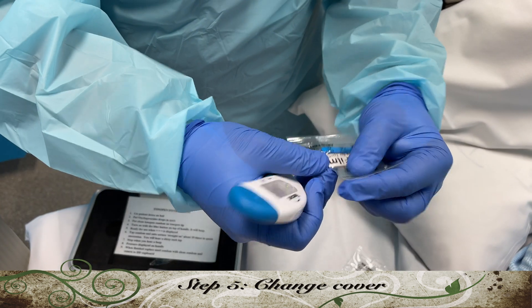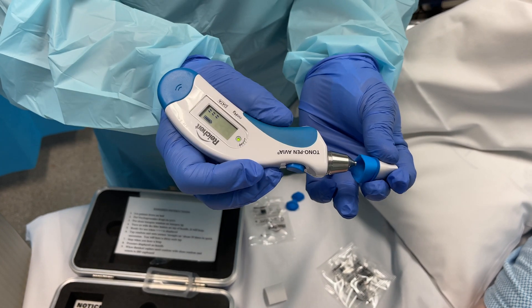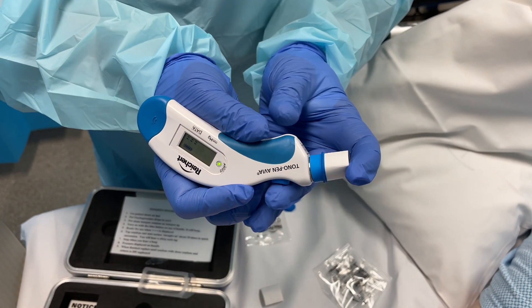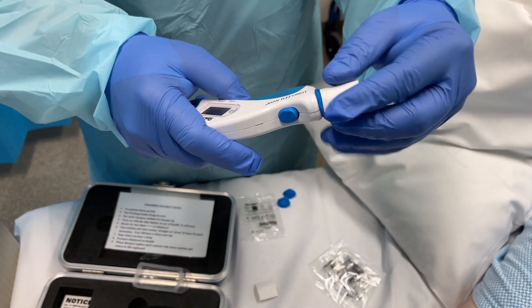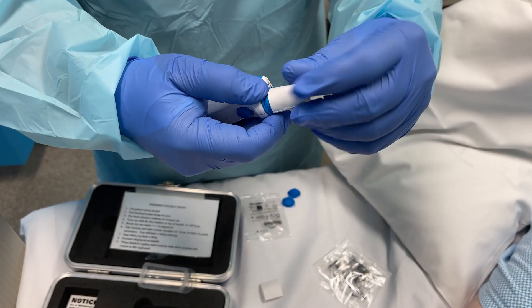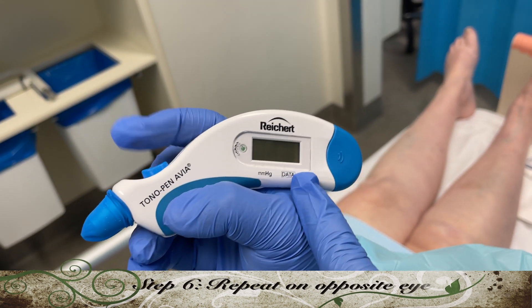Now you'll need to change your probe cover between eyes. Again, don't contaminate the tip — keep your hands away from the tip. The machine may time out, so just click the blue button to reactivate it.